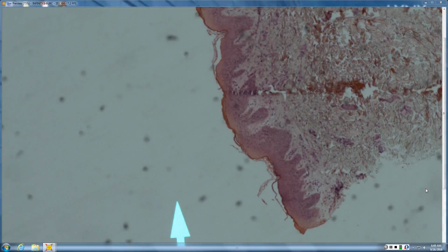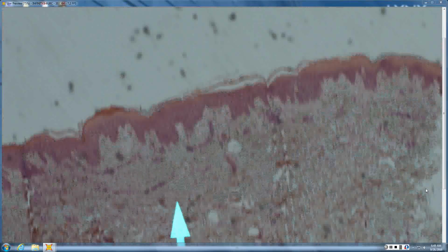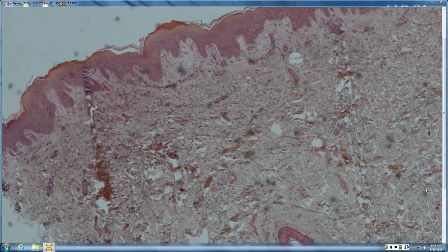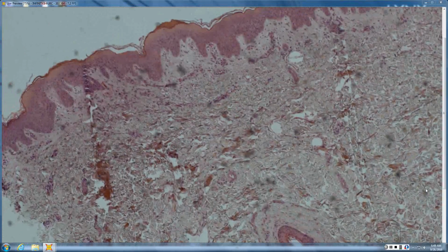Okay, number 4. Straight up and down. Like Dr. Russell says, you should be able to recognize things upside down, but it's still nice to have it right side up, in my opinion.